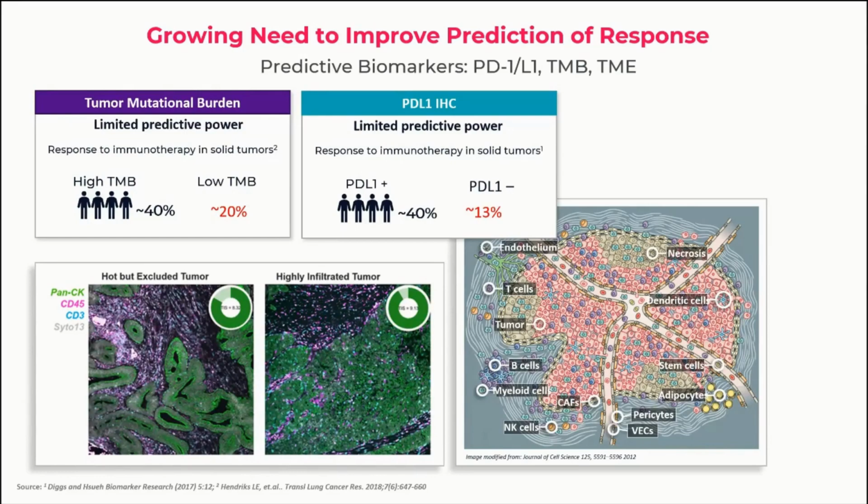And so why this is important is if we look at these two tumors at the bottom left here, if we were to grind these two tumors up and look at a bulk expression score, a bulk tumor infiltrating score, we can see that the tumor on the left doesn't have as high an infiltration with the purple cells infiltrating the tumor as the tumor on the right. So at a bulk expression level, these are very similar tumors, with a similar TIS score, a similar tumor infiltrating score, but the tumor on the right is highly infiltrated compared to the one on the left.